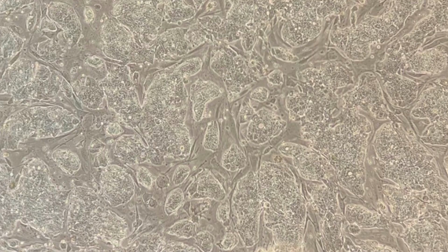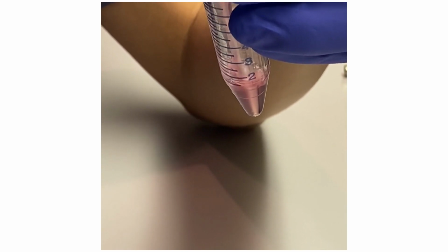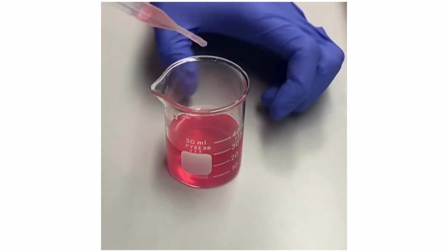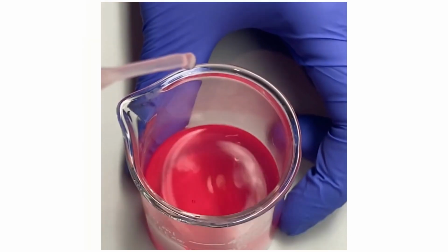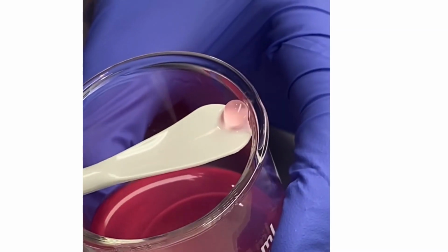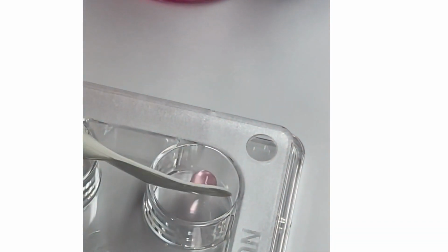In order to achieve this objective, mouse embryonic stem cells were initially cultured on a fibroblast-coated 6-well plate and later spherified. This video depicts our novel spherification process, in which cells are enveloped by dropping about 50 microliters of mouse embryonic stem cells in media into a sodium alginate solution. This 3D culture system was selected as it better emulates the in vivo environment of neospermatogenesis.